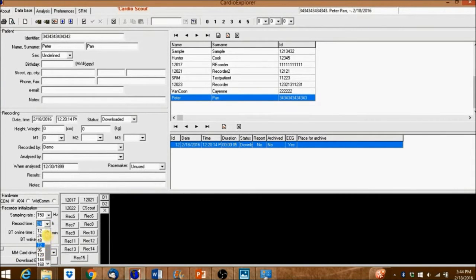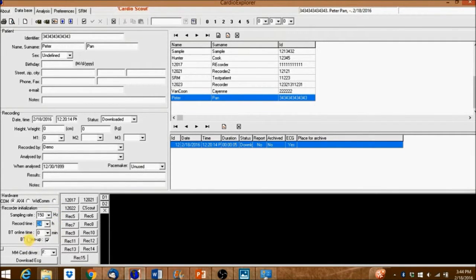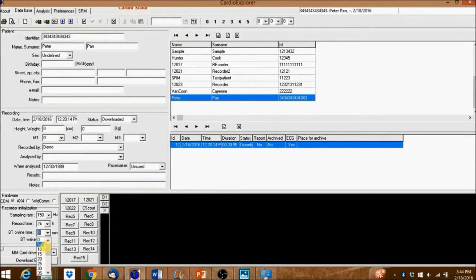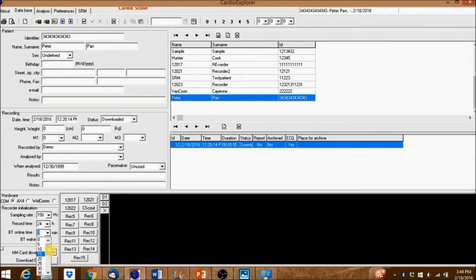Set the recording time from anywhere between 1 hour and 72 hours. The BT online time setting indicates how long the live stream is displayed in the online window to the right. Minimizing the BT online time will help you save battery power.